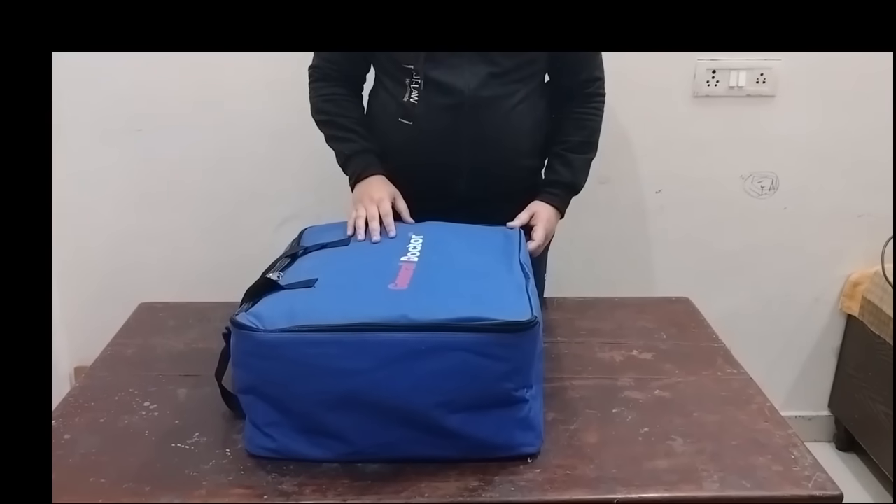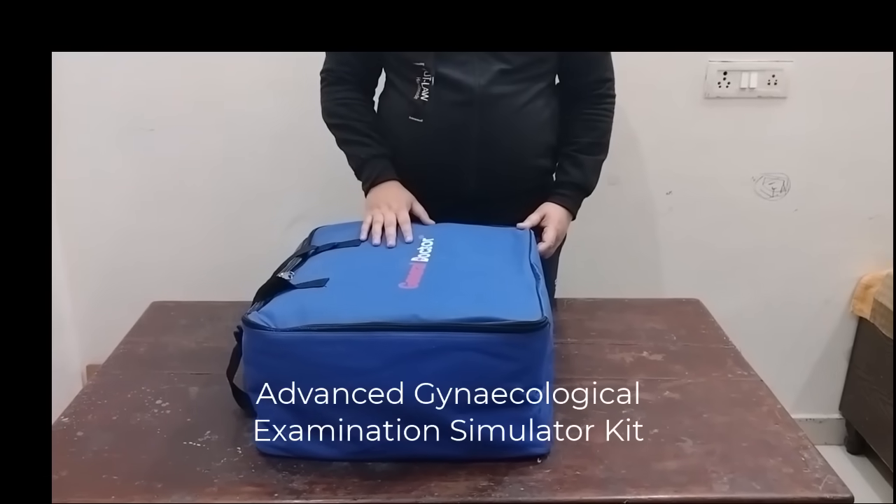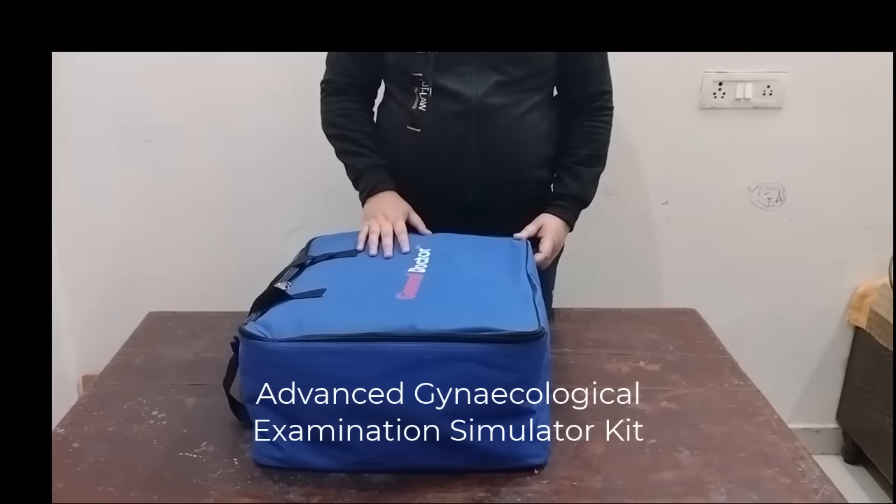Good morning. Today we are going to demonstrate our advanced gynecological examination model.